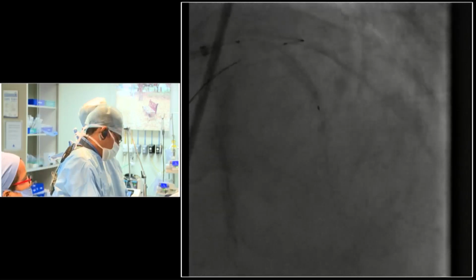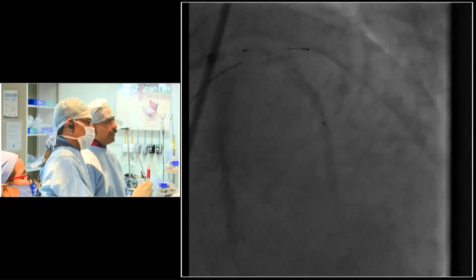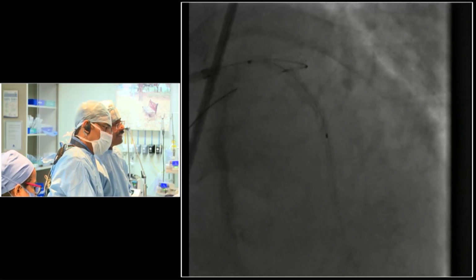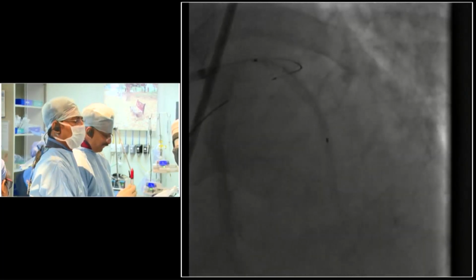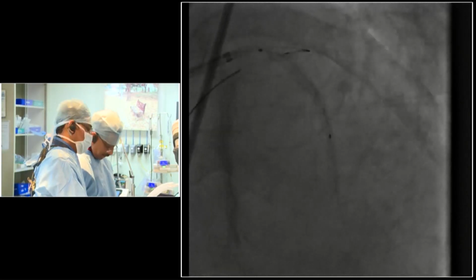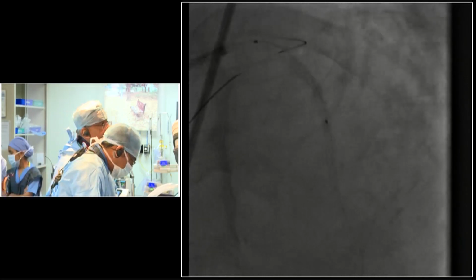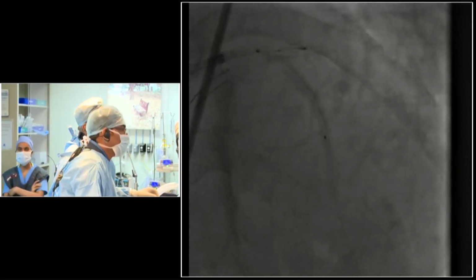Are there any other questions here? No, we are just watching what's going to happen. Maybe after the nitroglycerin, at the end of the procedure. Hopefully it will look okay. We had given some Nicorandil as doctors Mehboob and Subani had said. And now I'm going to just not occlude the circumflex and dilate it. One small check.